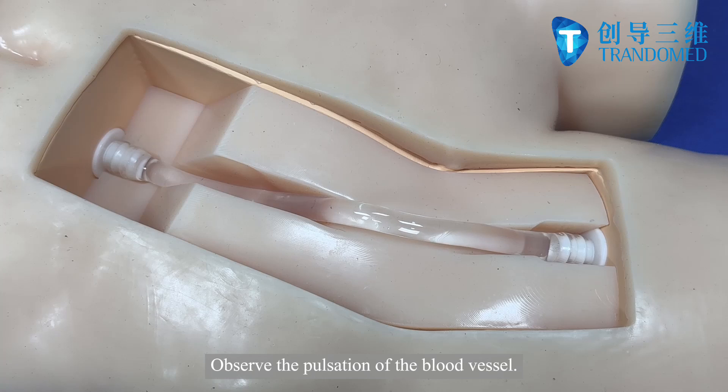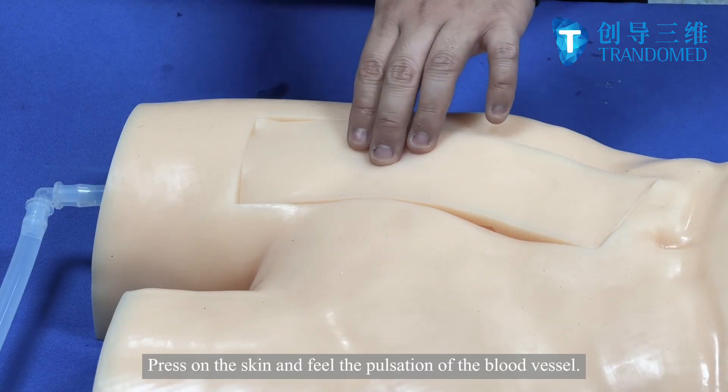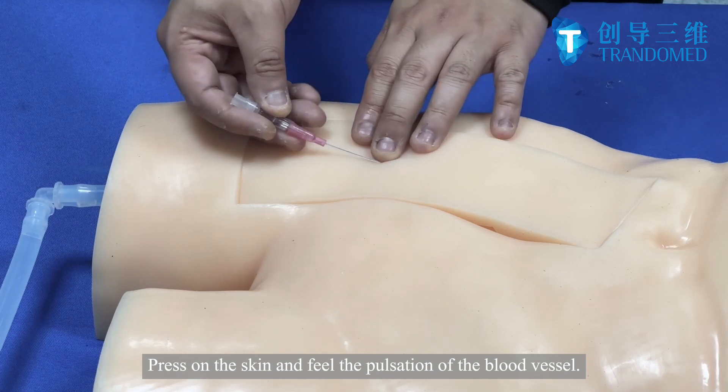Observe the position of the blood vessel. Press on the skin and feel the position of the blood vessel.